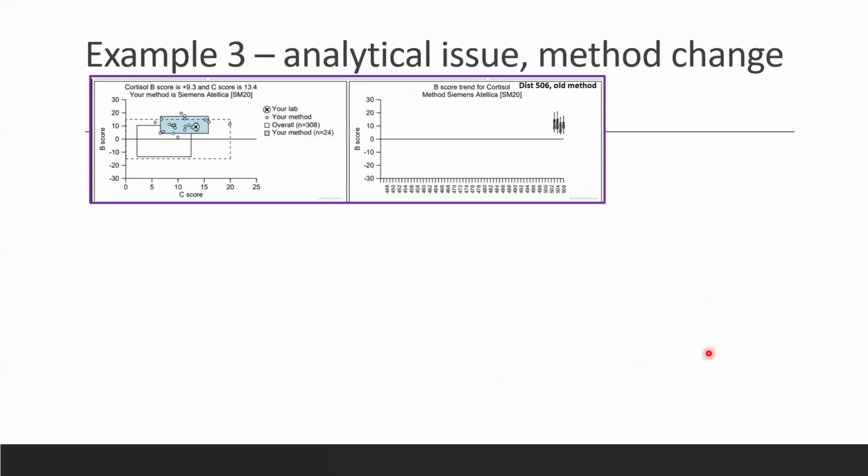So this is another analytical issue that I wanted to present, and this is something that probably some of you who are using the Siemens Atellica method for cortisol have come across. So in 2023, there has been a change in method for the Atellica Siemens cortisol users.